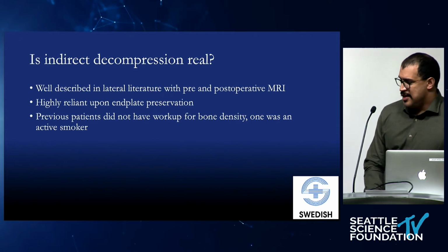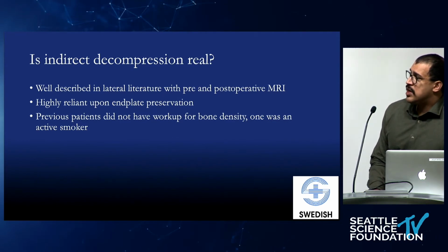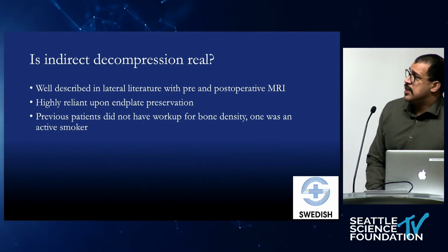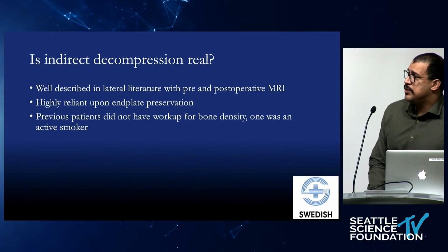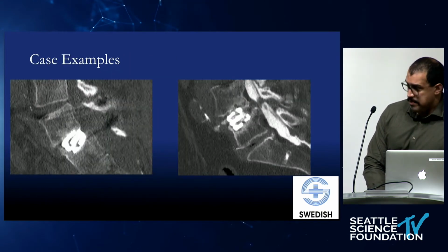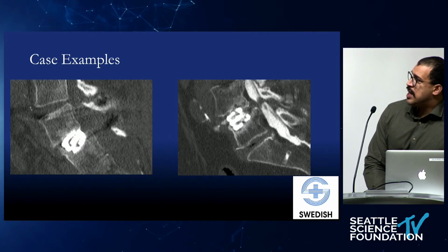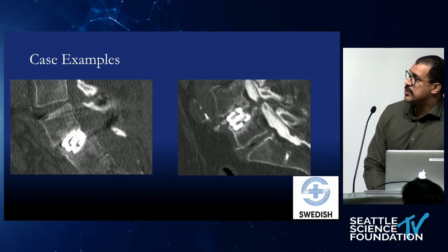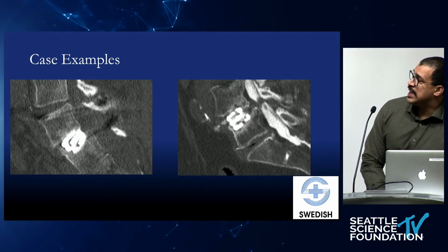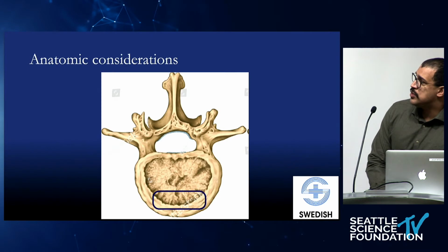We've all had Juan Uribe here talking through, he's come to our lateral course, and he just really stresses the importance of preserving the end plate. Whether it's doing a lateral, the same is true for MIS TLIF as well. If you're doing this case and you damage the end plate, you want to have the tactile feedback to know that that's happened, and maybe try a slightly different approach, because you're not actually getting the indirect decompression that you're looking for if you're damaging the end plate when you try to do this technique.